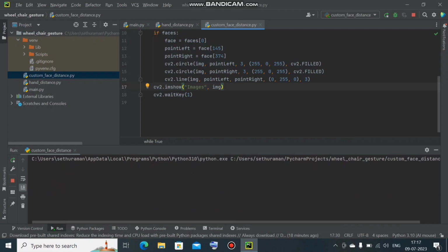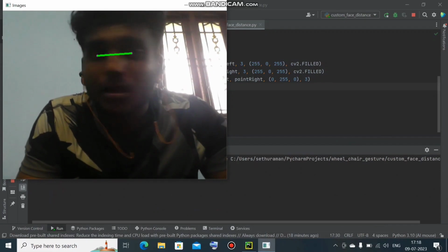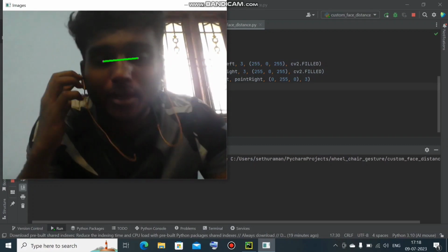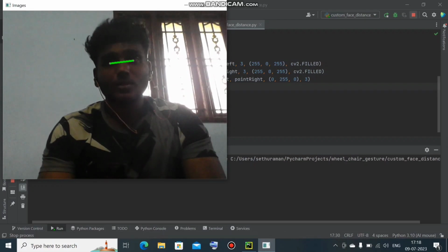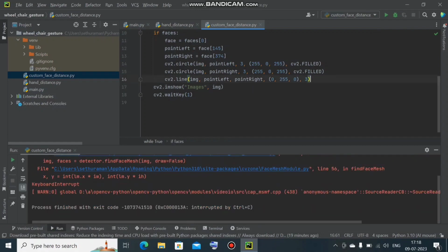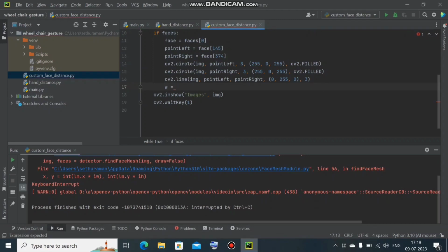Our basic concept is when we move forward, that line will look larger to the webcam, so it will assign one distance. And when we go back, now you see. When I come close to the camera, that line will be somewhat bigger in pixel size. When I go back, it will assign another distance. So like this we are going to find the distance between 2 points.